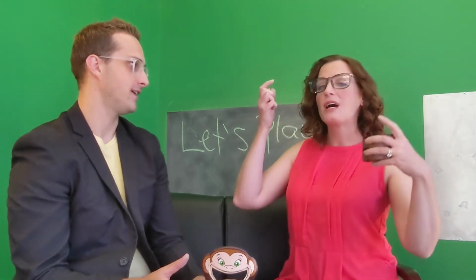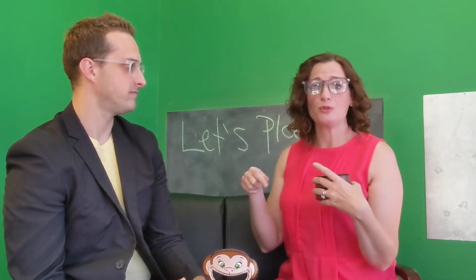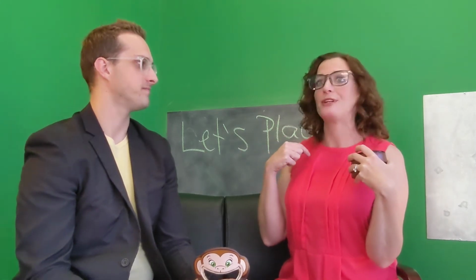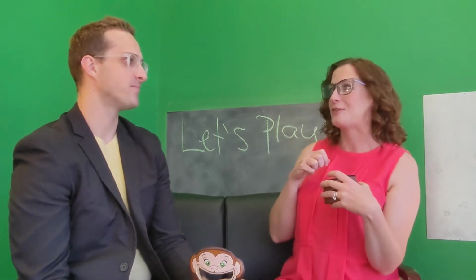Yes. So then I will have JJ wear headphones. A lot of times, if I'm in the room with the child testing, I'll put headphones on too, so that I'll say, okay, now we're going to put headphones on. Mom or dad, they're not going to be able to hear it, so just me and you can hear it. Yeah, that's our little secret.